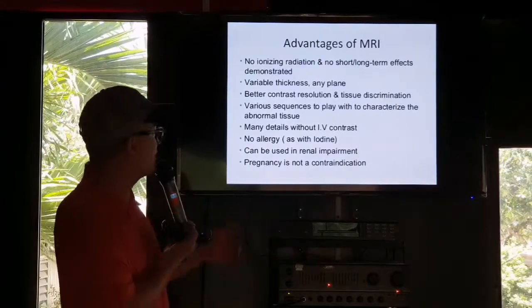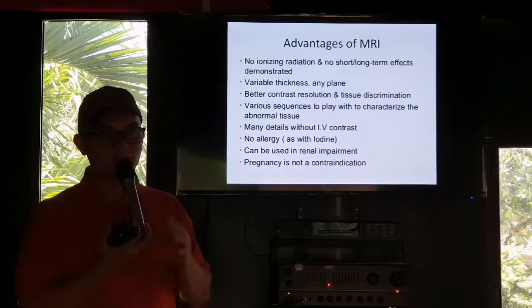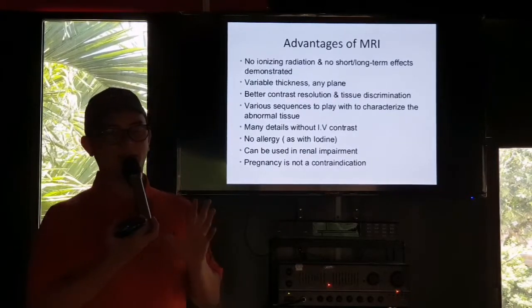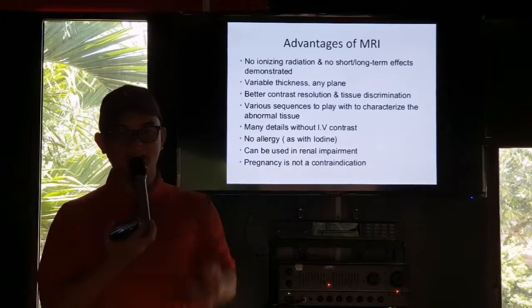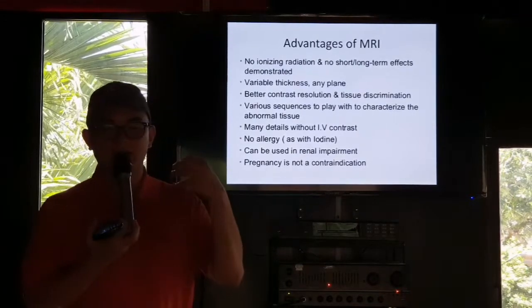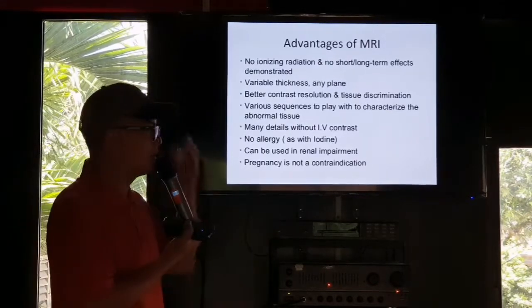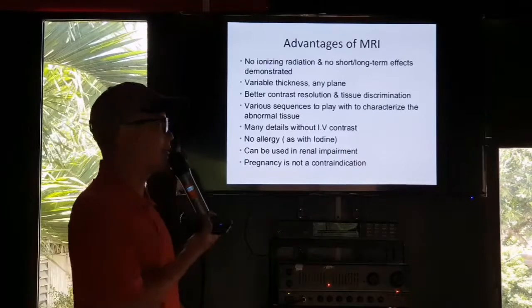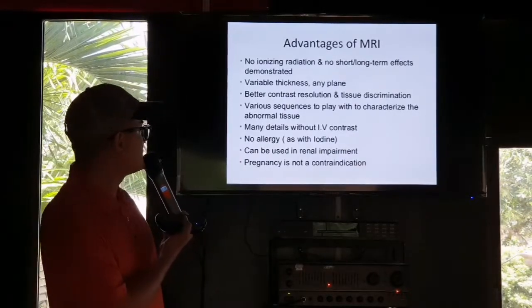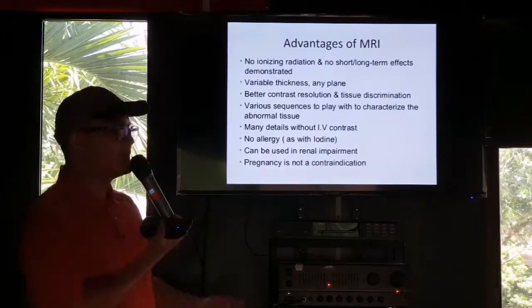So this is what I was telling you. In MRI, even for us, we can easily distinguish if what is inside a sinus is blood, or is it pus, or is it more proteinic secretion, or a fungus ball. So all of this you can see with an MRI, but it is very difficult to do that with a CT scan.